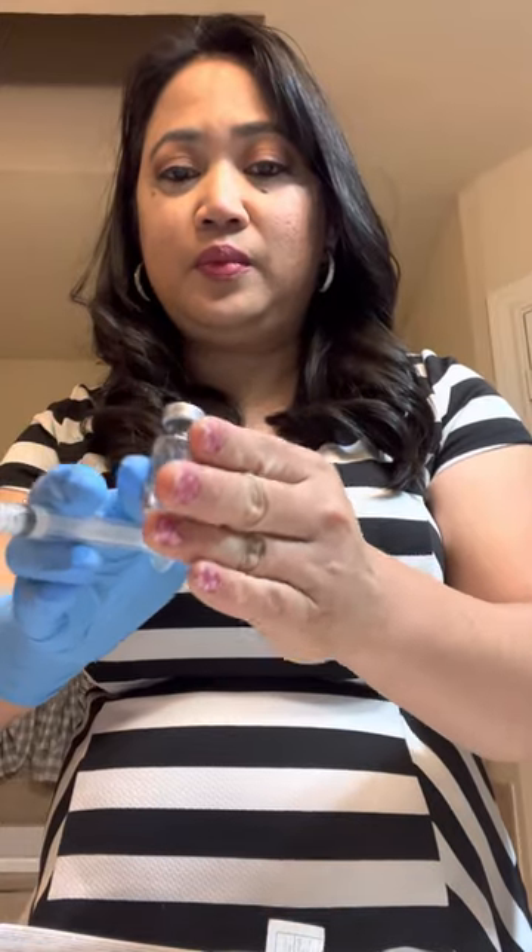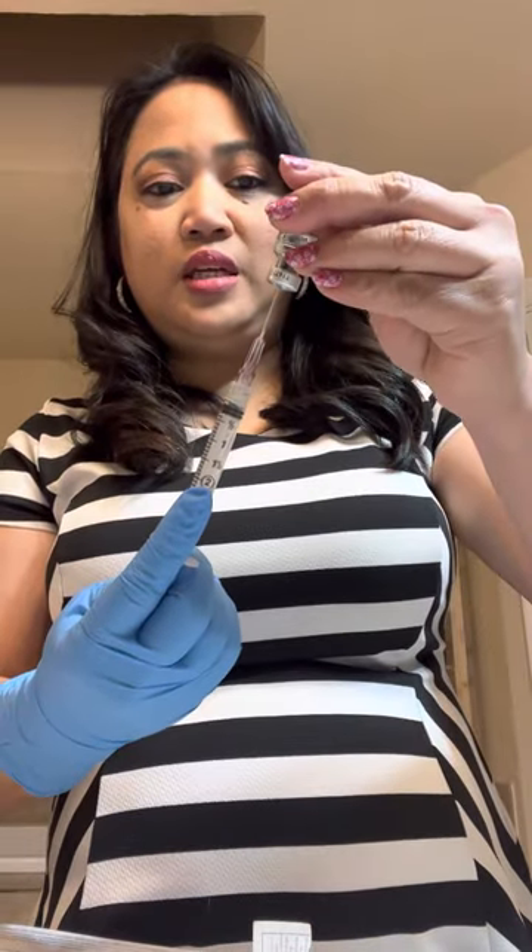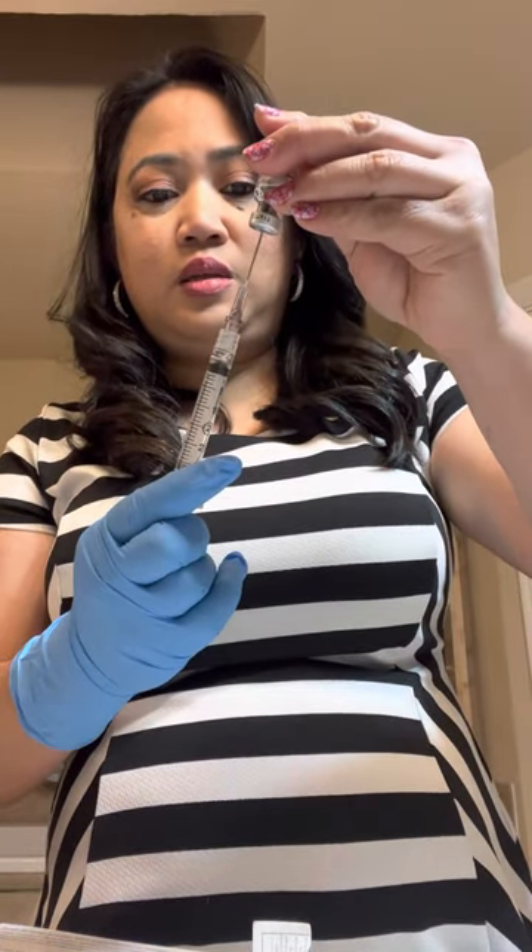Do not shake it — it will get dissolved very quickly. If you want, you can roll it just like that. Then I want to put a little bit of air in there, put it upside down, and get the meds.